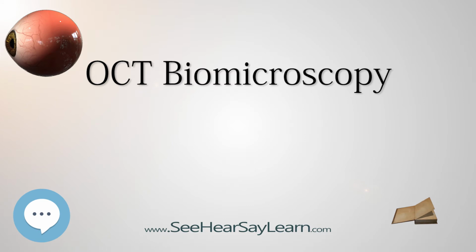Like slit lamps, OCT imaging devices provide magnified, cross-sectional views of transparent tissues in the eye. Unlike slit lamps, OCT devices store tomographic images that can be 1, acquired consistently using the same protocol at each patient visit in every location around the world, 2, operated by less expensive personnel with less training and experience than a slit lamp, 3, objectively and quantitatively analyzed by the user and/or computer software, and 4, retrospectively or longitudinally assessed in both clinical trials and in clinical practice.